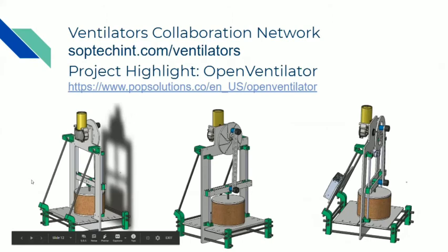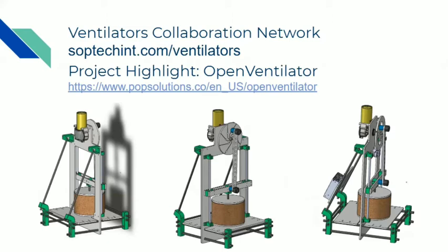If you can change the slide, please. There we have the Spartan model, the CAD design. If you want, I can show it working. I already have a bellows system here that's working, so in a few minutes, if you want, I can show it to you. I still have to do the testing in the laboratory, but I'm pretty sure that we're going to pass the normal ventilation rate, volume, and that kind of clinical standards.